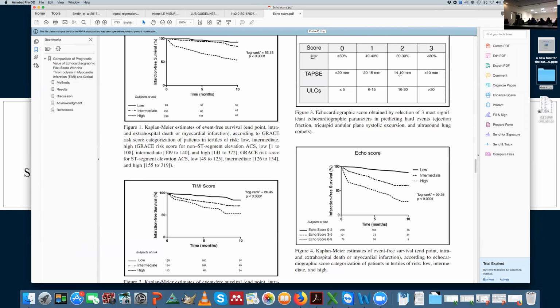Anyway, you said randomized studies. But what do randomized studies mean, in your opinion? So, randomized studies, for me, in this kind of application in medicine, don't exist. So we cannot do a randomized study about lung ultrasound. So what do you mean by randomized study? Okay, what I mean, and now I will tell you what I think in general, but you know, because we have spoken about this many times together.